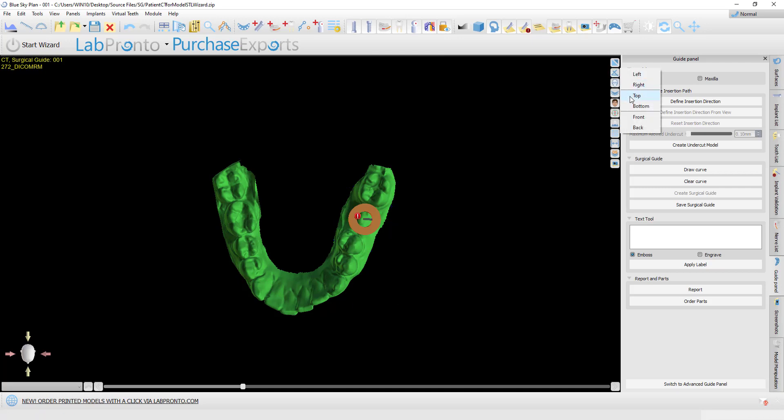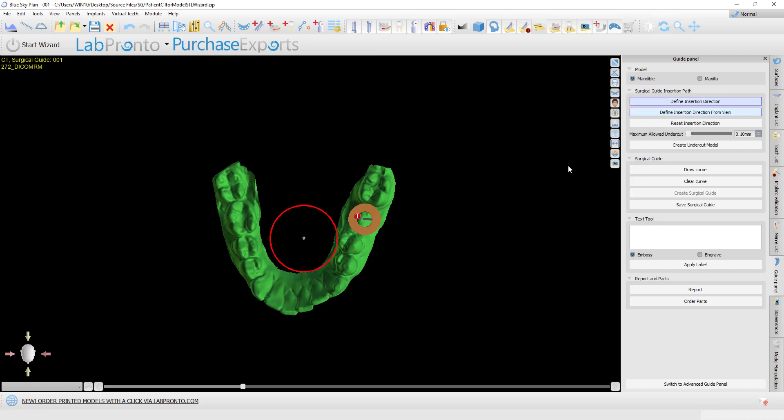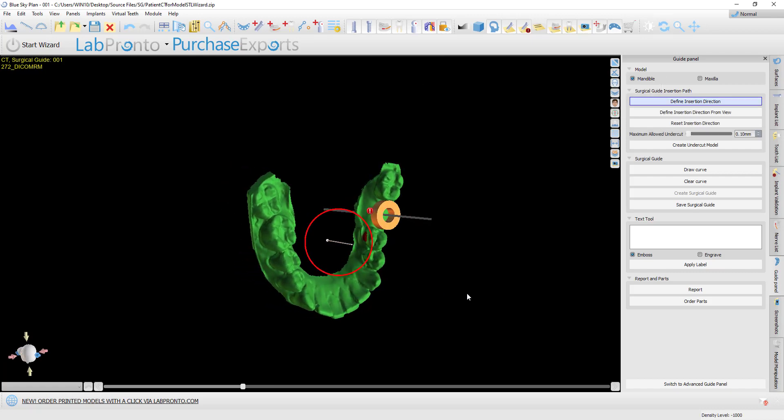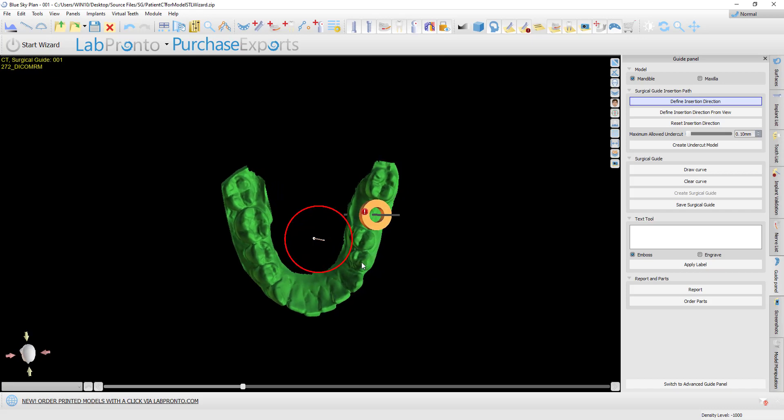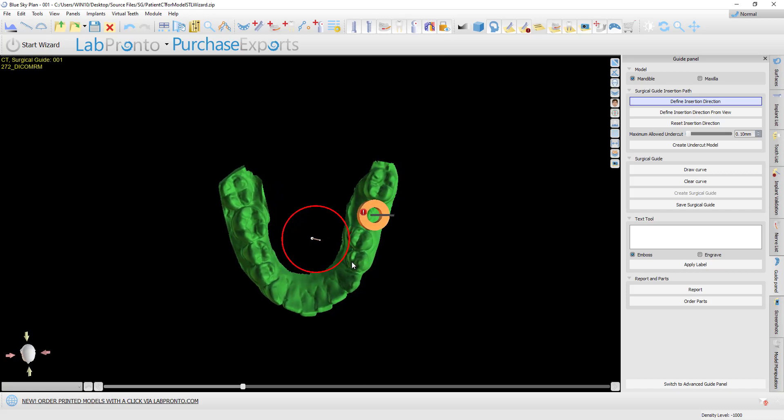That's equivalent to viewing the surgical guide from the top and defining the insertion direction. Here we can see by our second premolar the undercut that would automatically be removed in versions prior to 4.82. This was done automatically with no opportunity to change it.